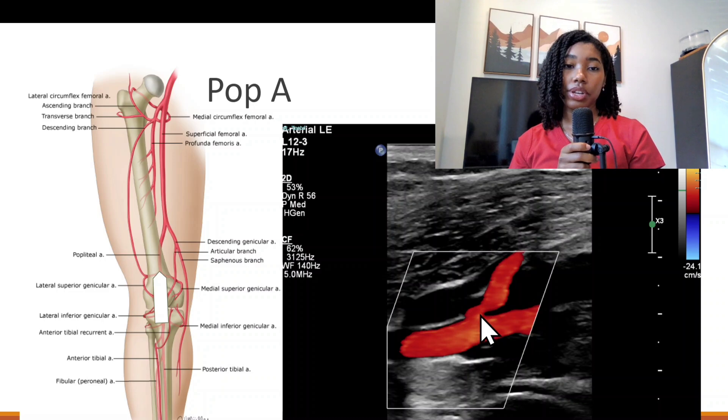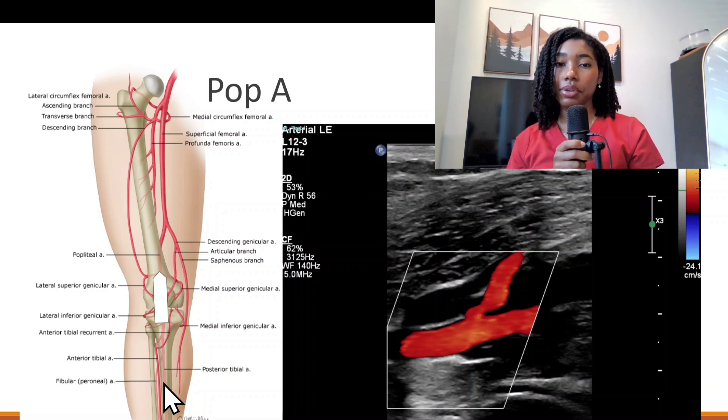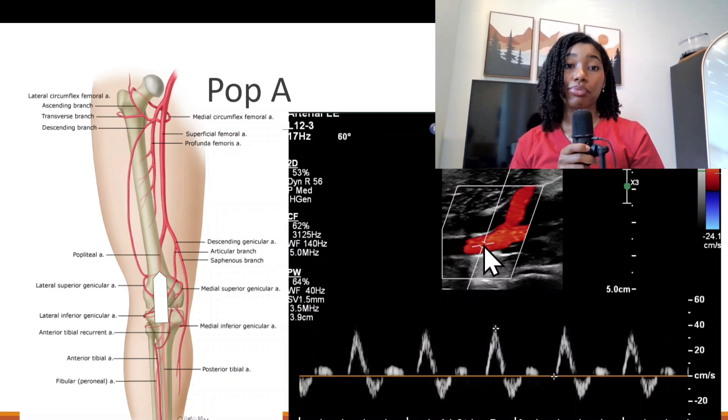Here is the anterior tibial artery. This branches off the popliteal artery and courses more anteriorly and laterally as you can see here. Obtain your pulse wave image proximal to that bifurcation area.